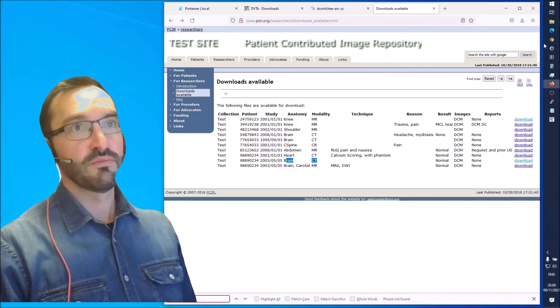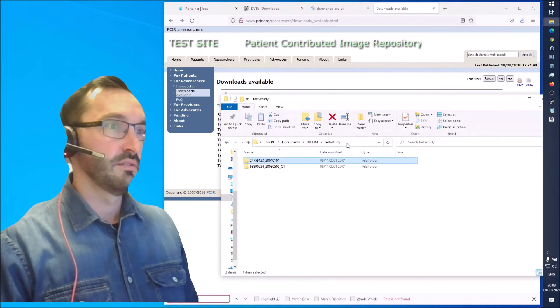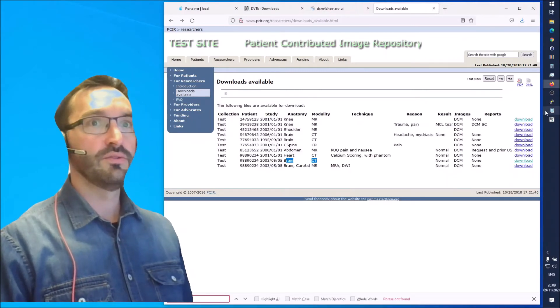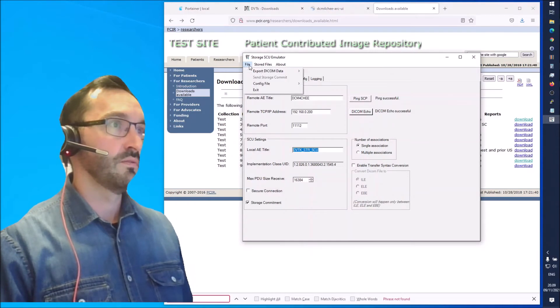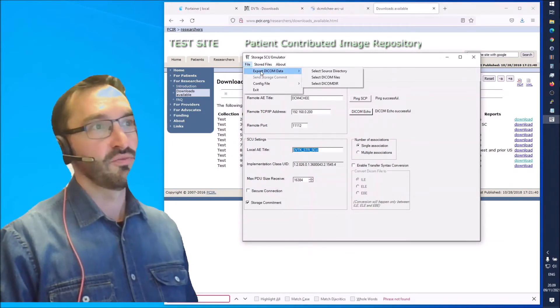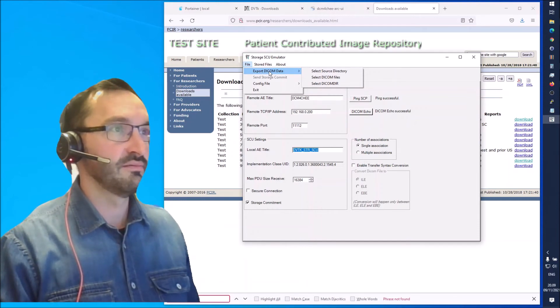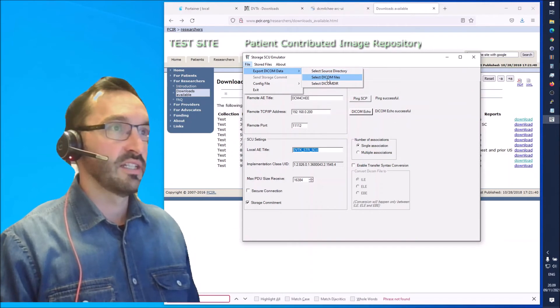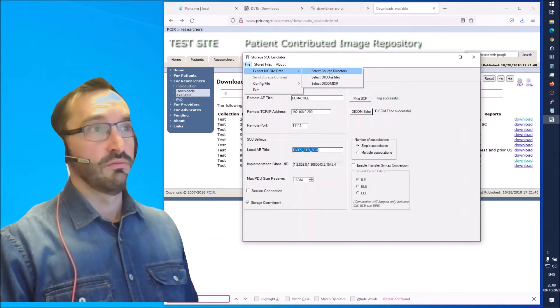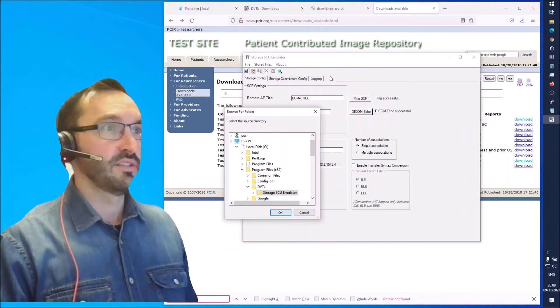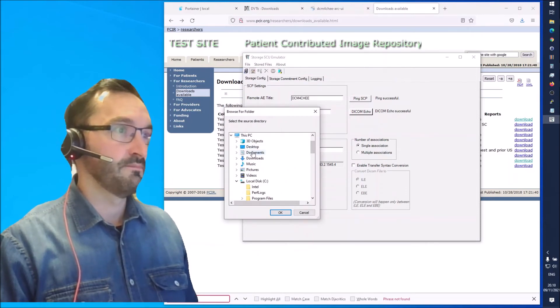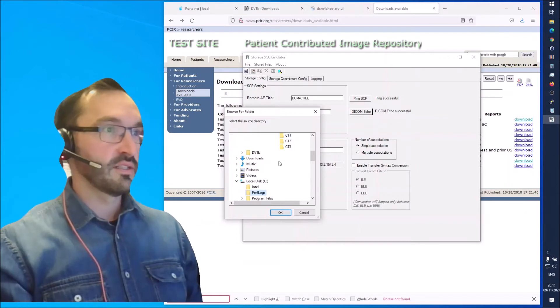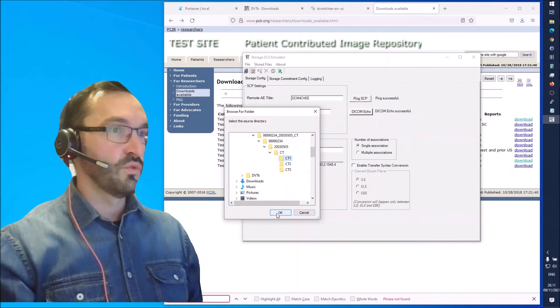I used 7-zip to unzip those. You can have them here in the test study folder. In order to send the DICOM study we go to file and export DICOM data. Sounds a bit weird but exporting kind of means sending here. Then we can select DICOM files, DICOM directory, or a source directory.